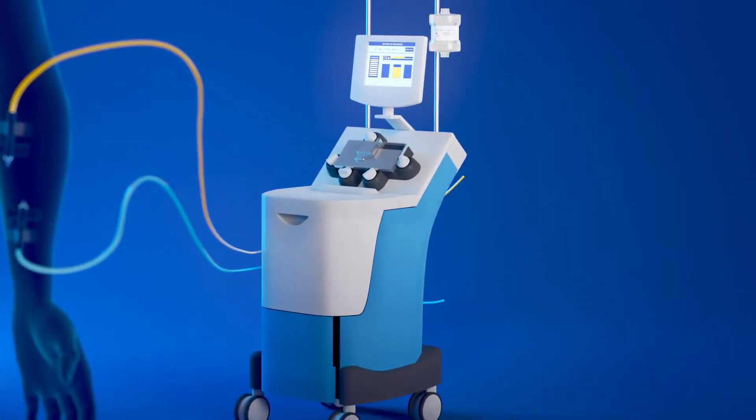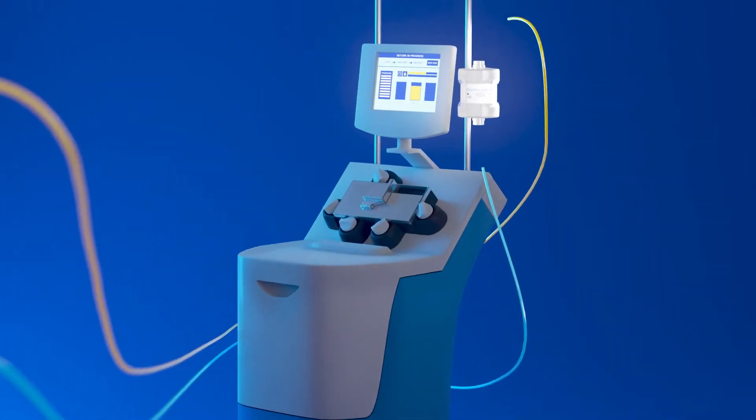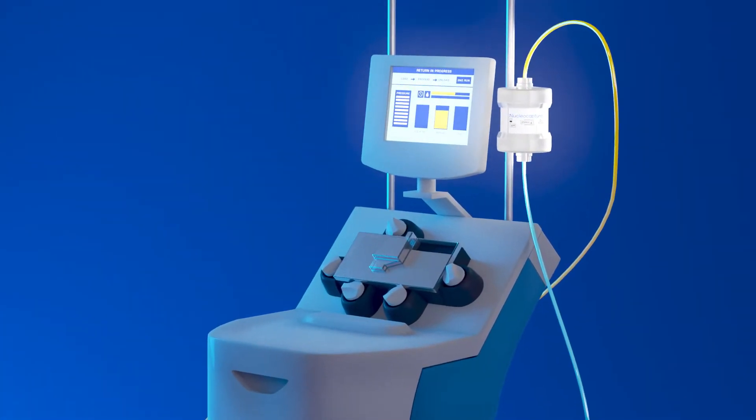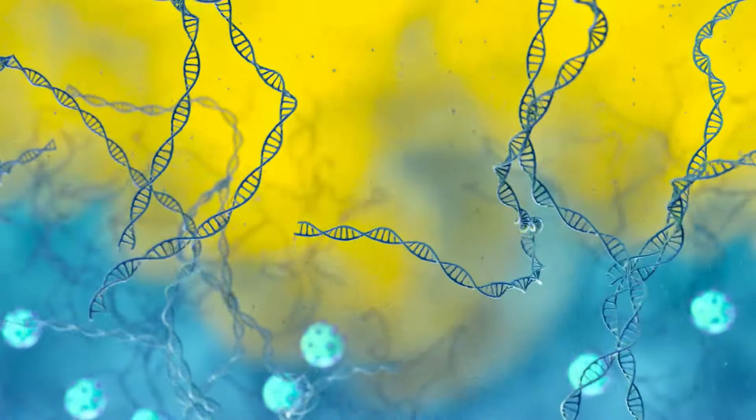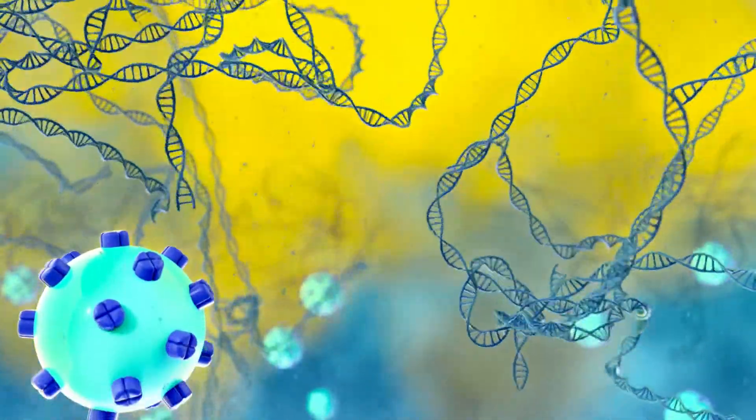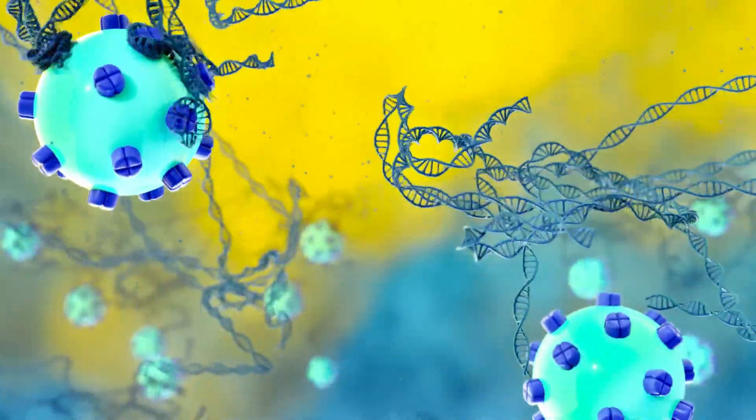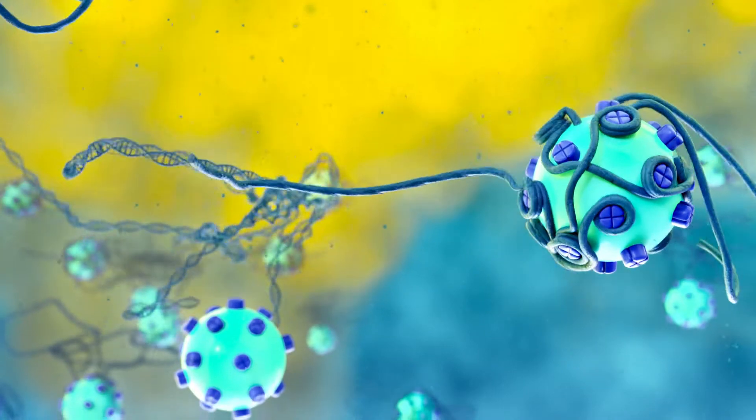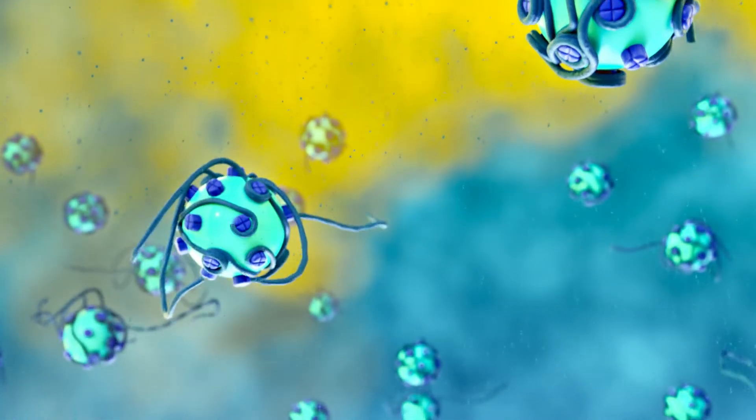A single pass of NET-contaminated blood through the nucleocapture device results in 95% clearance of NETs from plasma. The cell-free DNA binds to the conjugated histone complexes with single-digit nanomolar binding constants.